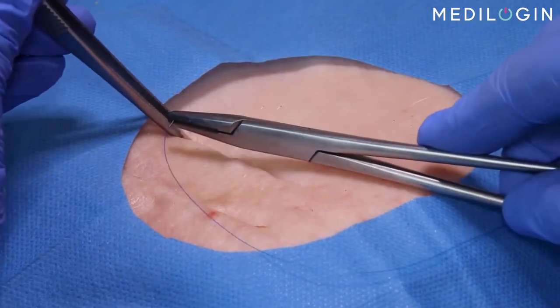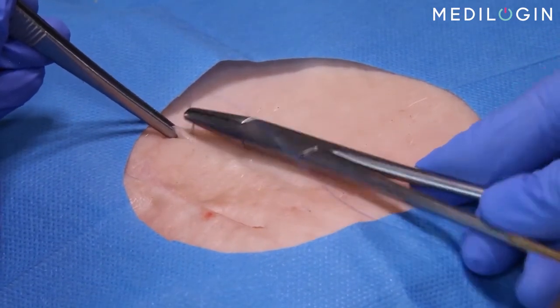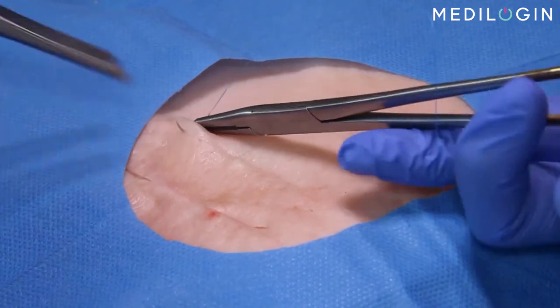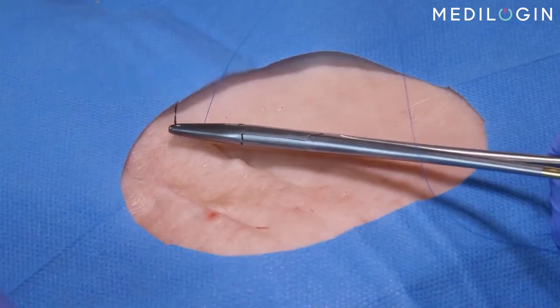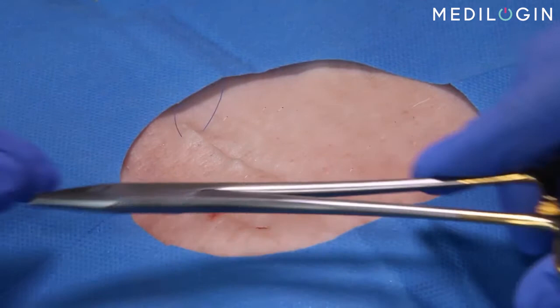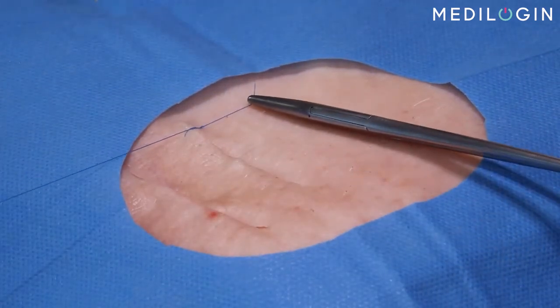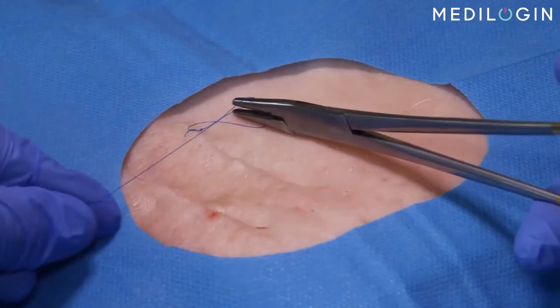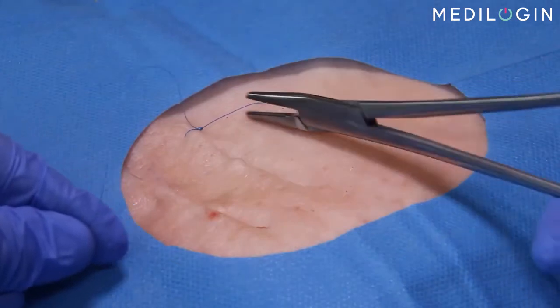The skin is penetrated perpendicularly, and the needle passes through the epidermis and dermis. Through supination of the wrist, the needle exits on the opposite side at the same distance from the wound edge and at the same height. A normal surgical knot is then tied, 2 loops to the right, 1 to the left, and finally another loop to the right.